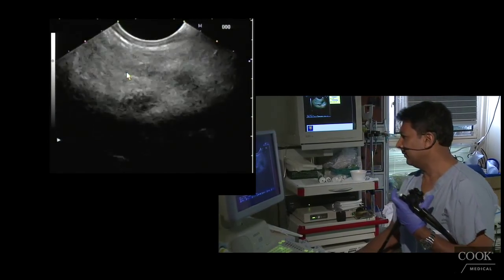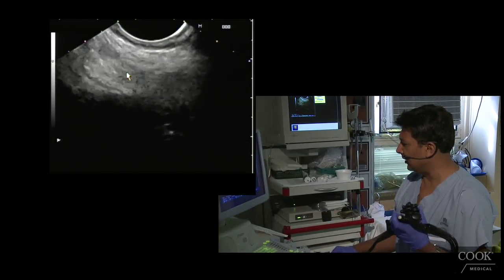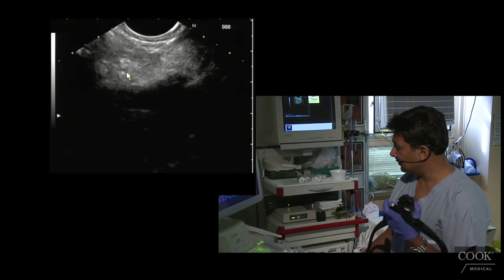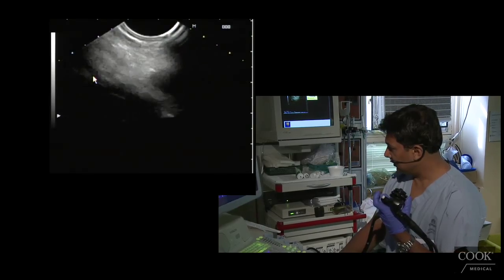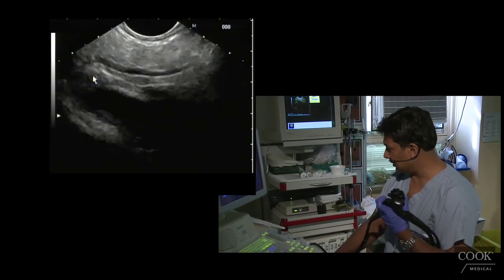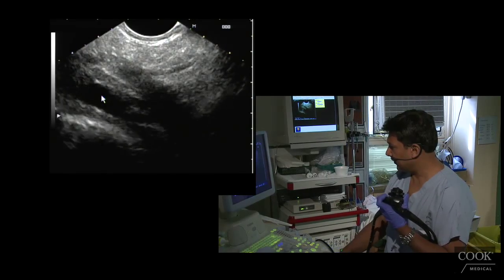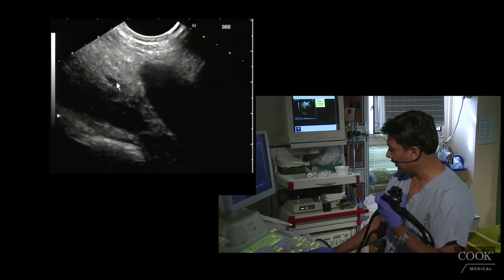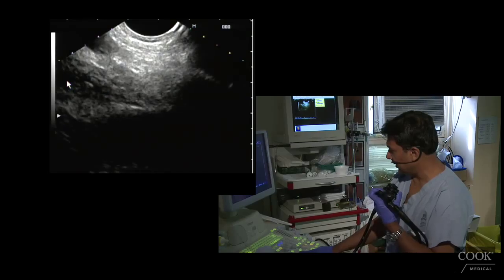So that looks okay, and you see that there's no signs of PD obstruction. It's a thin PD. See if I can see into the head a little bit from here. So the head of the pancreas is down here. Okay, and you can see, I think this is his bile duct here. We can follow that down into the head. You can see the pancreatic duct next to it there. There we go. You can still see some PD there.